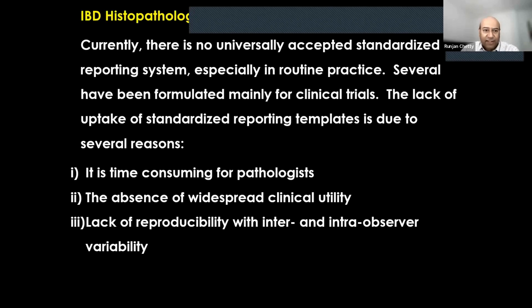There are several reasons for the lack of uptake of standardized reporting of activity in IBD. It's time consuming because there are several parameters that need to be quantified, and in some cases the scoring takes a while to do. Interpretation really does muddy the waters here. The lack of reproducibility within yourself and between individuals doing the scoring is quite evident. Therefore, even in the clinical trials environment, they get 3 or 4 pathologists to score and look at the consensus score when accepting the final decision.